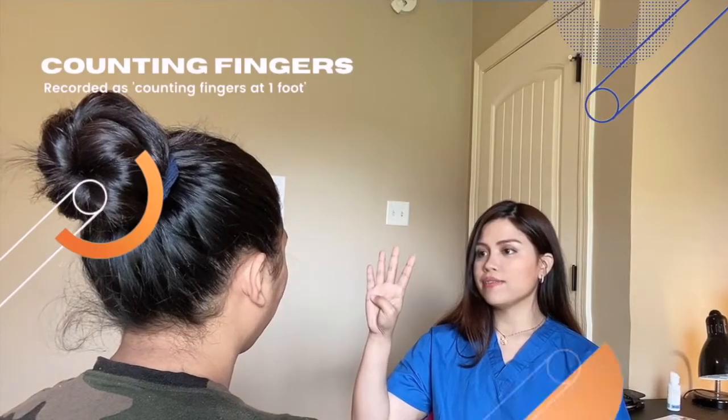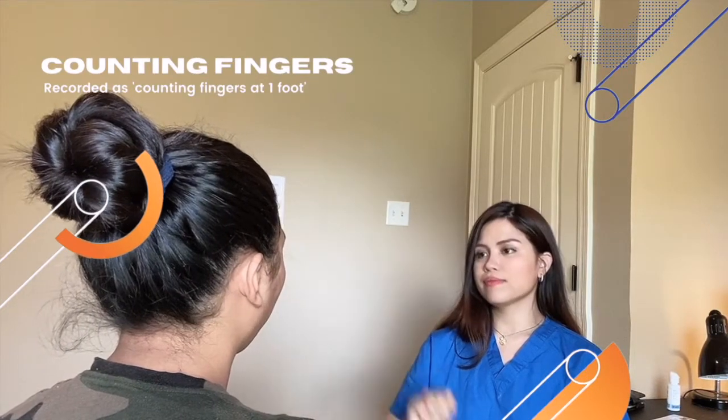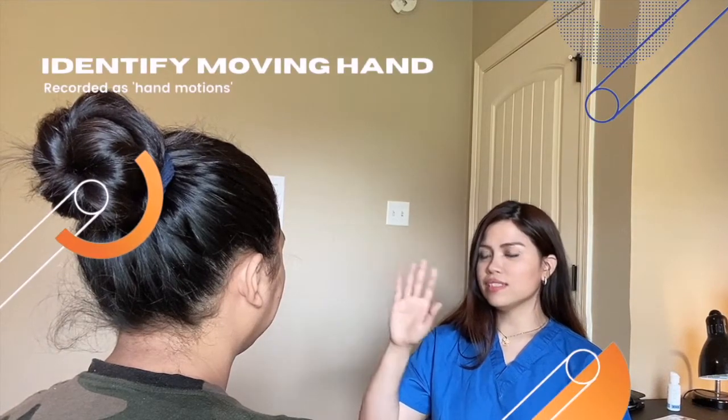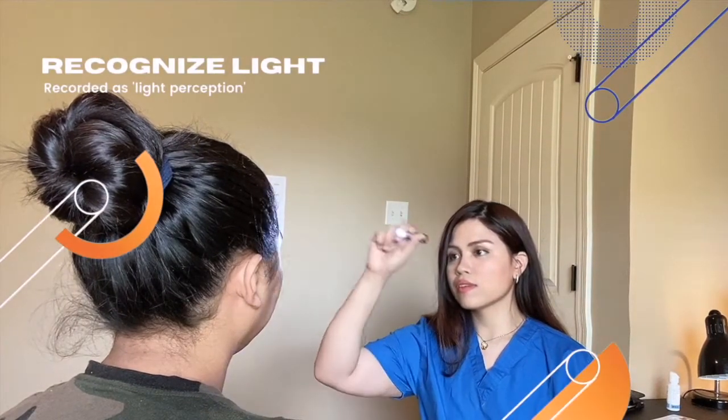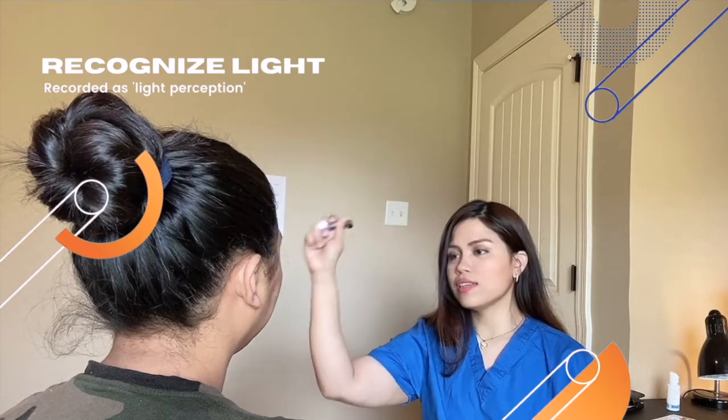If the patient cannot read the biggest optotype, that means he has low vision. The examiner can use his hand and ask the patient how many fingers are shown. If the patient still cannot identify counting fingers, the examiner can wave his hand and ask the patient if he can identify the moving hand. If the patient still cannot see the examiner's moving hand, use the pen light and direct it on the patient's eye in all directions.